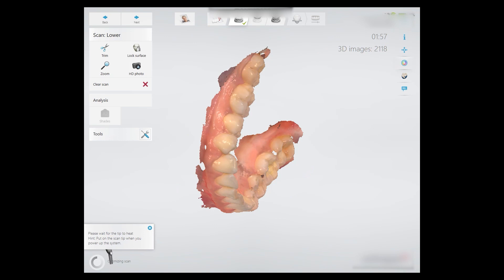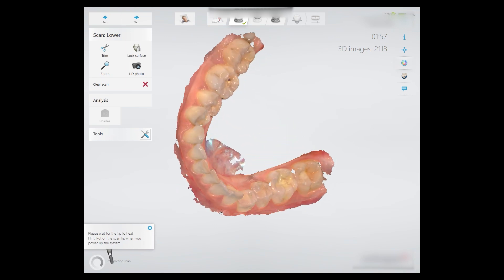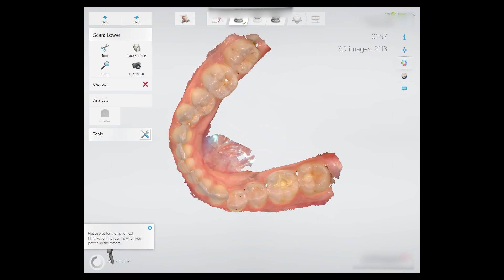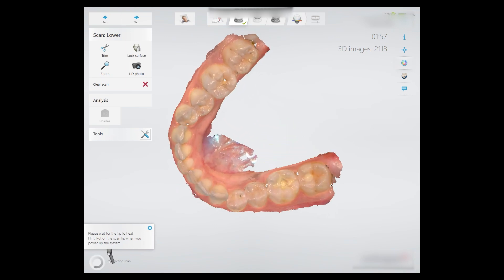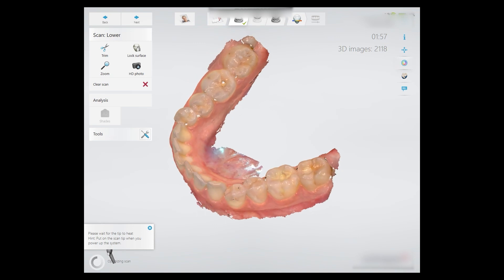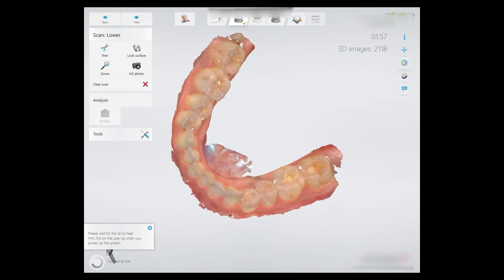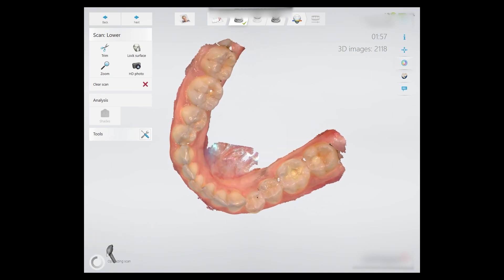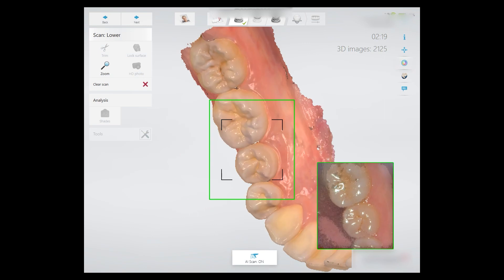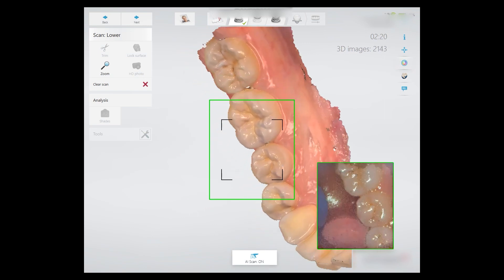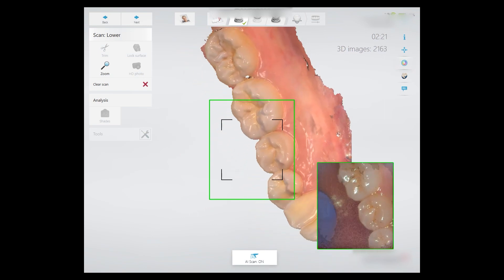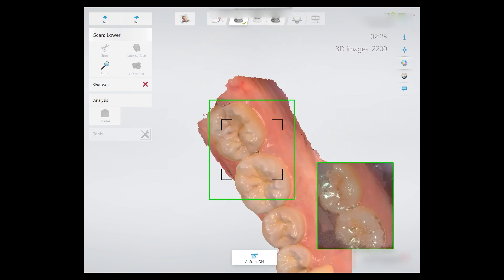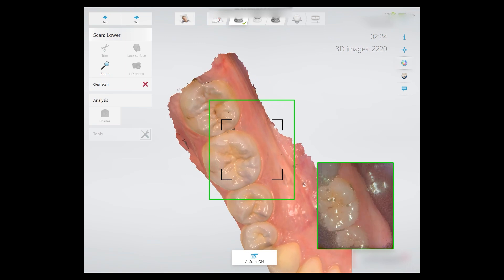Inspect the captured scan for holes and make sure enough gingival margin is captured — three to five millimeters is usually enough. In case there are holes or missing gingival margin, re-scan the area required. There is no need to re-scan the whole arch.